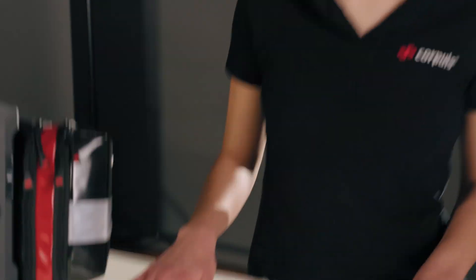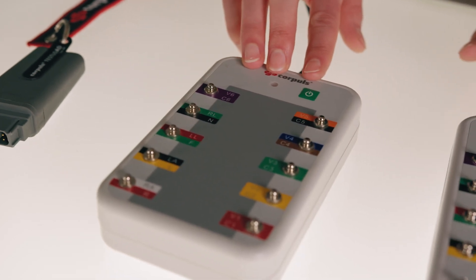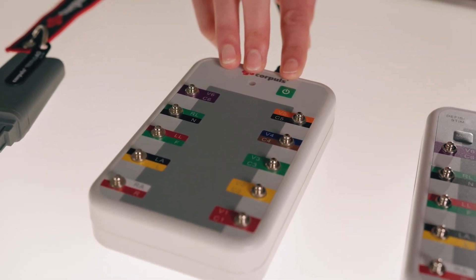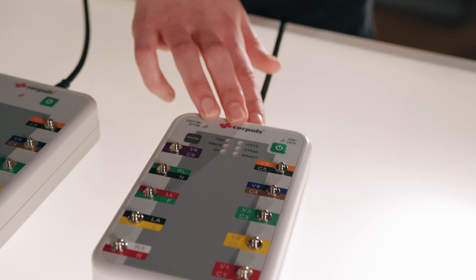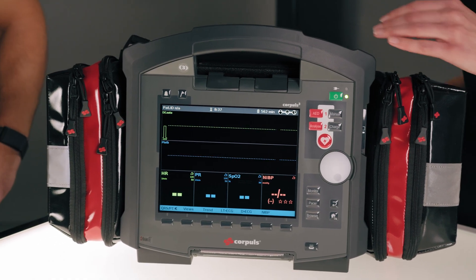In the next step we will perform the function test of the defibrillator. We have three different test options for this: the test load, which serves as electrical resistance; the test box, with which you can also check the ECG cables during the monthly tests; or the corpus simulator, which also has the option of importing different ECG rhythms. We have decided to carry out the function test using the test load.